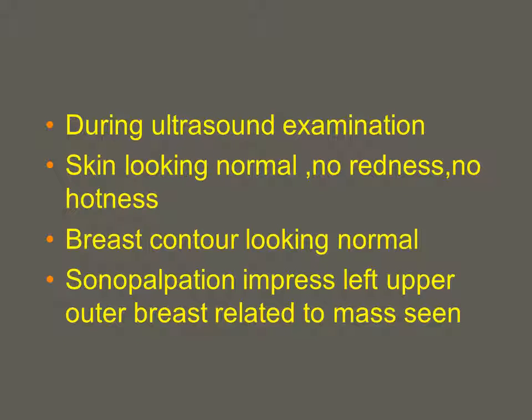During examination, the skin is normal, no redness, no hotness, breast contour looking normal, symmetrical on both sides, left and right. On palpation of the breast, there is a left upper outer breast lump, related to the mass seen later on by ultrasound and mammography.